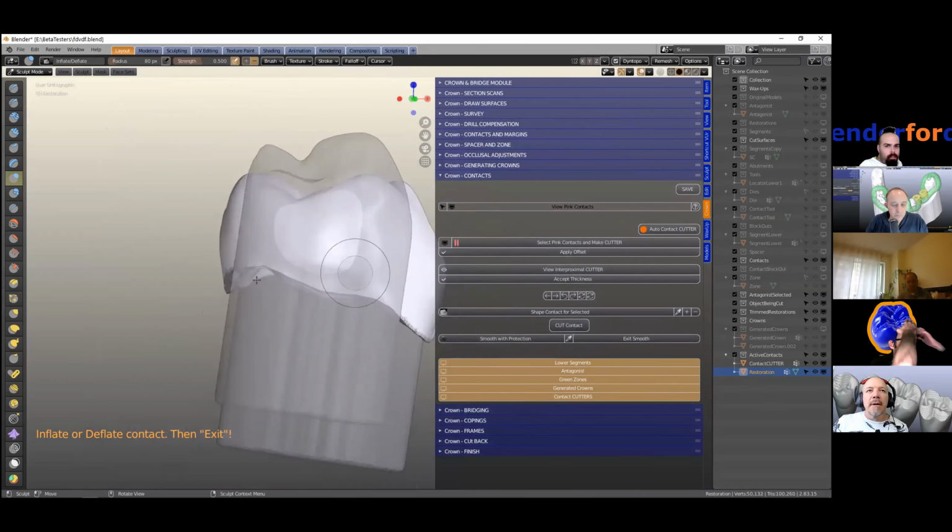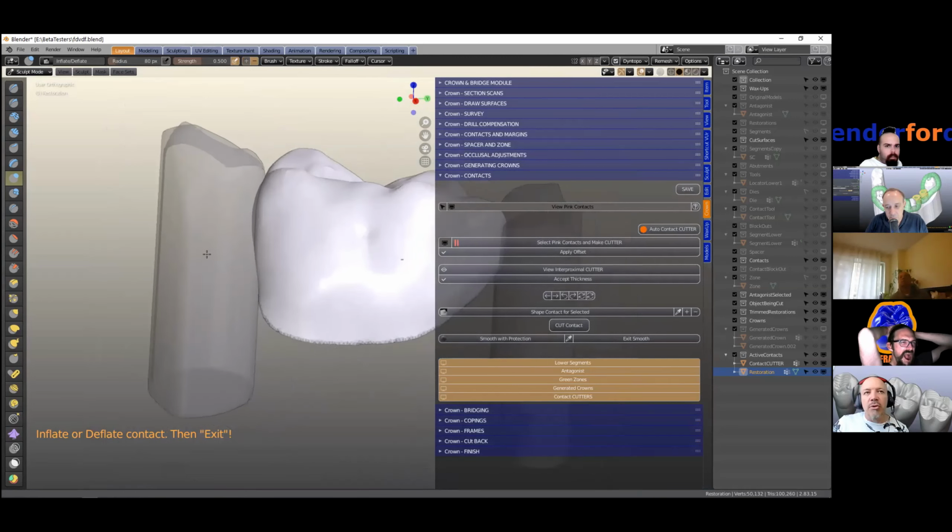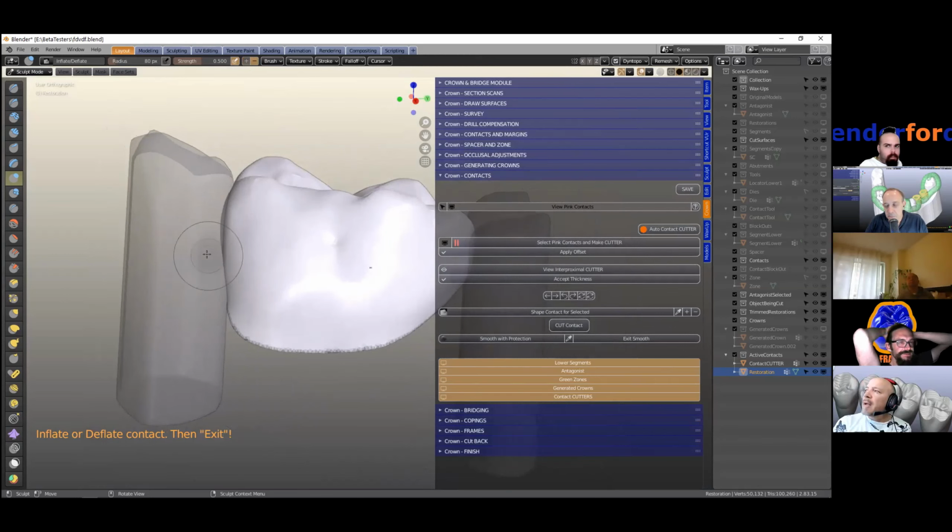Most dentists like these very broad contact areas, to make sure. That's one thing, Wolfgang, when you're doing a tooth prep, the actual contact design is just as important as the tooth prep, because often in the lab I've experienced that the patient has a food trap, but the contact hasn't been changed, so we are expected to make a crown to get rid of the food trap, but the contacts haven't been redesigned.